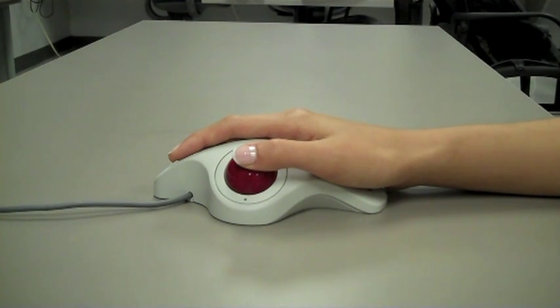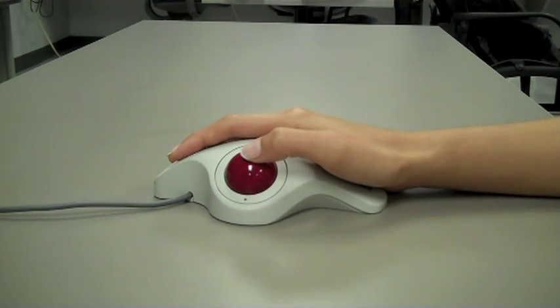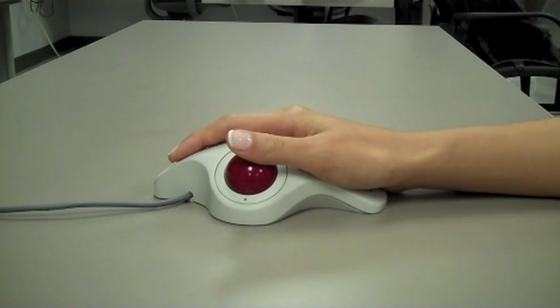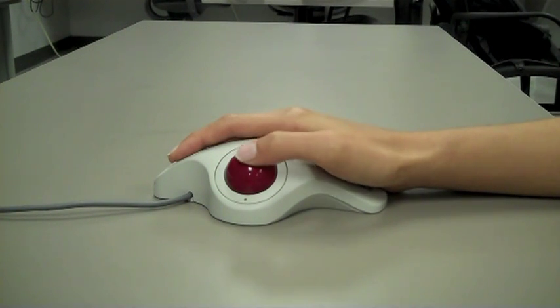Now let's have her navigate the trackball with her thumb, up and down, side to side, and in a circle. Notice her thumb is extended as she scrolls upward, flexed as she scrolls downward, abducted and adducted as she scrolls from side to side. The thumb goes into flexion, extension, abduction, adduction when the trackball is moved in a circle.